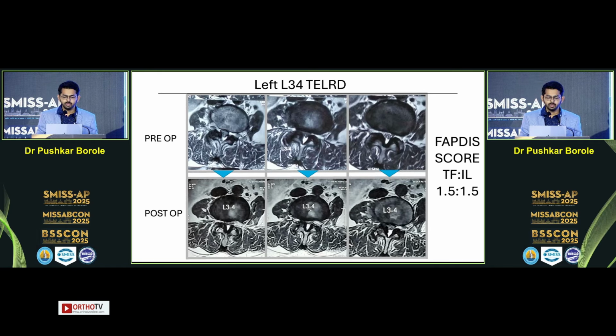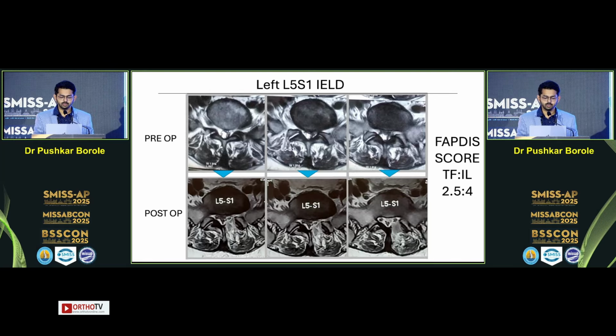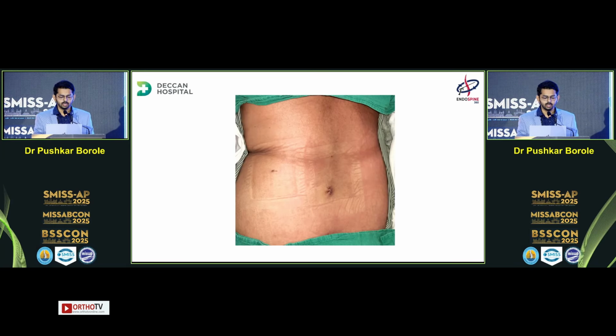So we went transforaminally for the L3-4 level. Transforaminal endoscopic lateral recess decompression was done. We can see pre-op and post-op MRI. Interlaminar decompression was done for L4-5, and L5-S1 interlaminar discectomy was done. These are the clinical pictures.